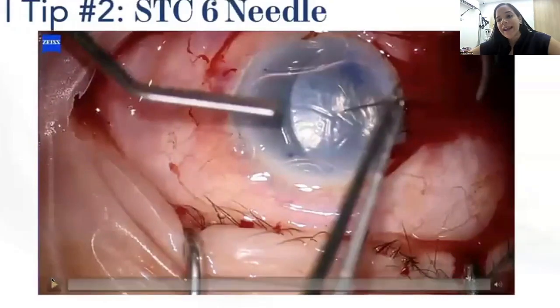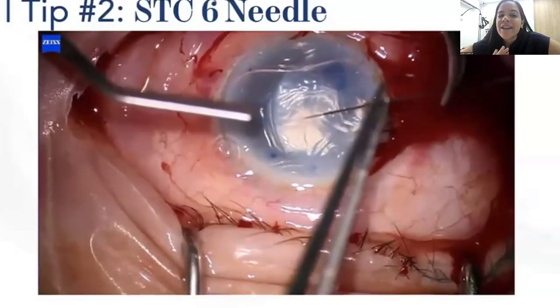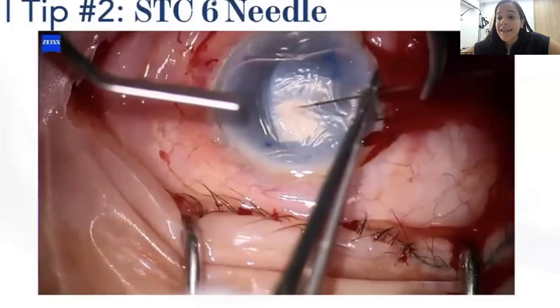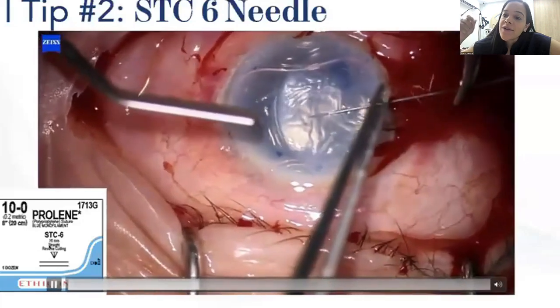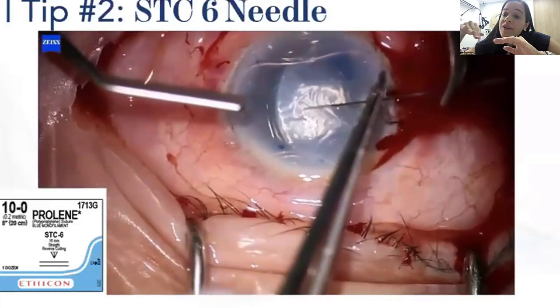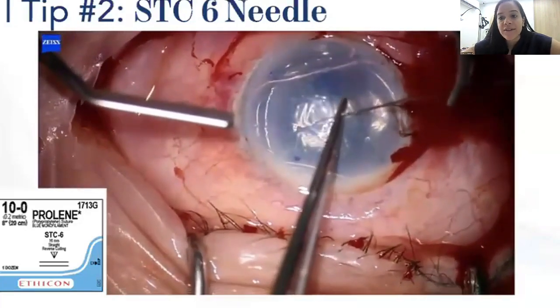And tip number 2, the one that I love the most, is the use of the STC6 needle. First you inject air, and then you take a straight needle, the STC6, and insert your needle through the cornea until you touch the stroma of the graft, and you move it in the direction that you want. What I like about this technique is that you don't touch the endothelium, so you won't have endothelial cell loss.